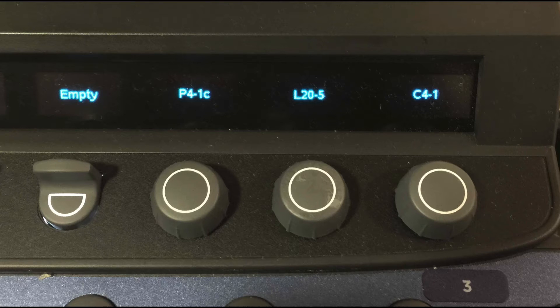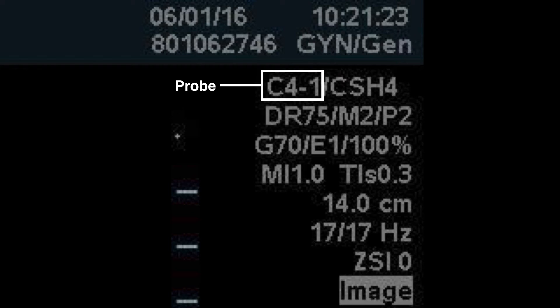You're going to press on the dial button, which also serves as a button. You'll hear it click, and you'll have selected the probe that you want. On the upper right-hand corner you'll see the probe that has been selected — in this case the curved 4-1.